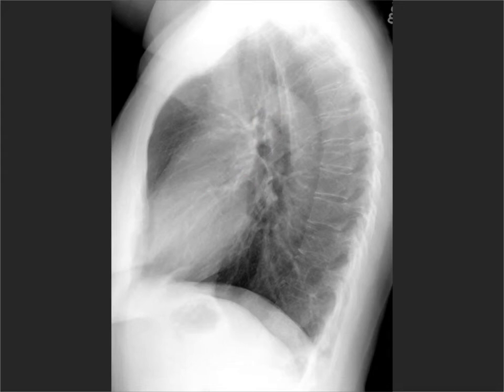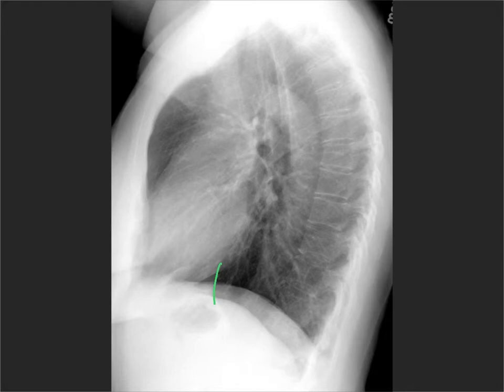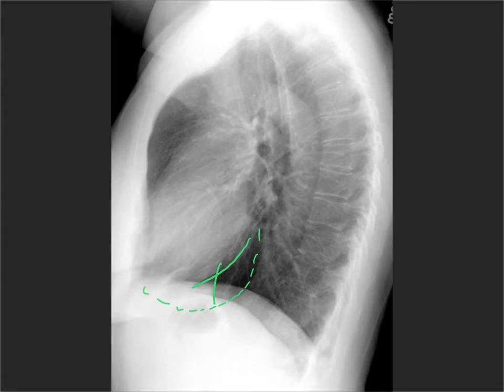Coming down to the bottom of the heart, there is a little curvy linear opacity right at the bottom of the heart that leads down towards the abdomen — that's the inferior vena cava, and you're always going to see that. A nice marker for left ventricular enlargement is that the left ventricle usually doesn't come more than about two to three centimeters posterior to the inferior vena cava, but as it gets bigger it starts to enlarge backwards and downwards. Conversely, the left atrium is going to be enlarging back posteriorly.